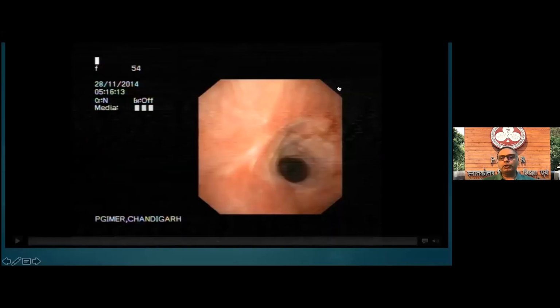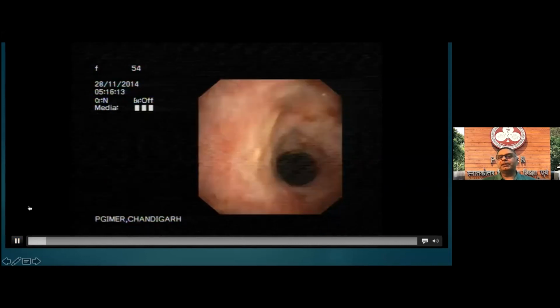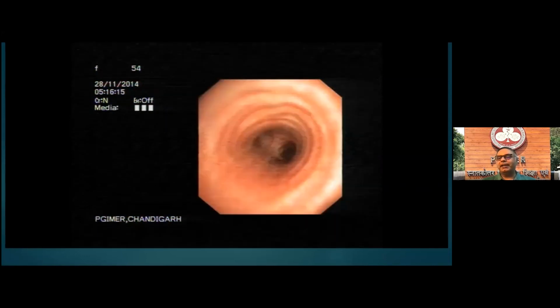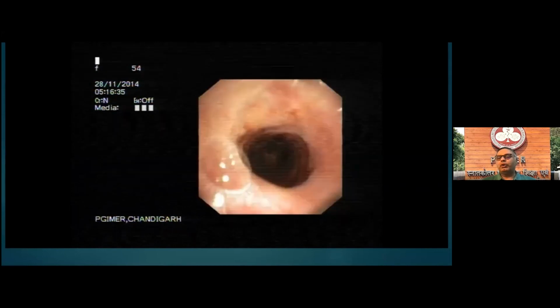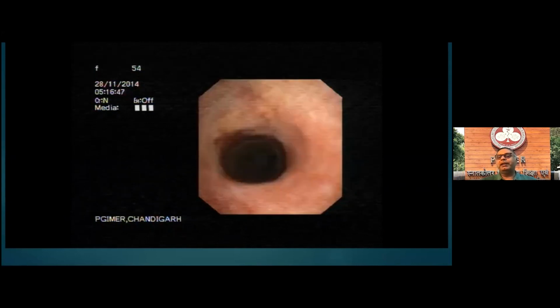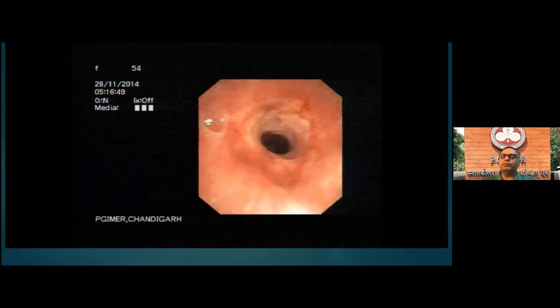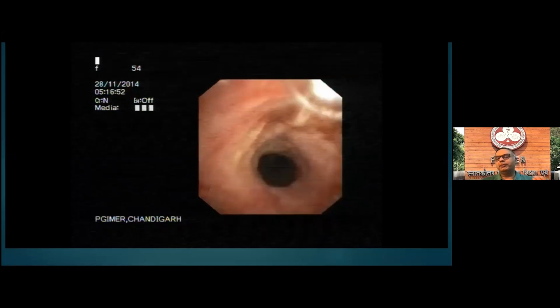This is the post-operative bronchoscopy of the patient. As you can see, this is post-operative 6 weeks. The area is well healed. You can still see some amount of narrowing, but if this kind of airway is consistent with the lifestyle of the patient, we would not tend to overdo it or take in this patient again.